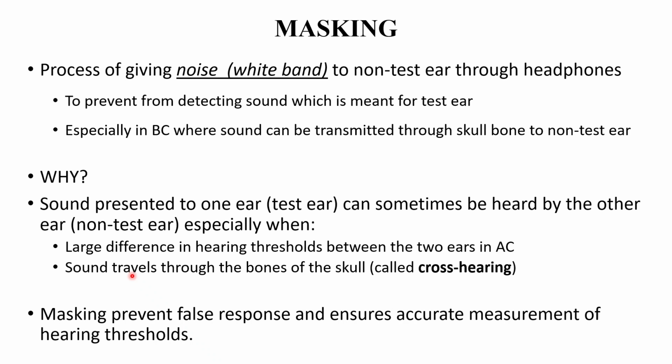So to prevent cross hearing, masking is always carried out in bone conduction. Masking prevents false response and ensures accurate measurement of hearing thresholds in the test ear.